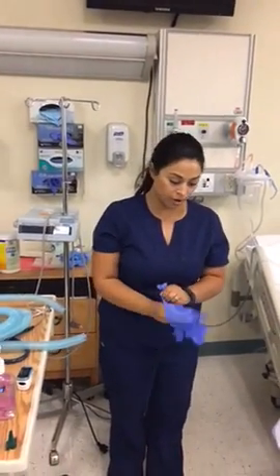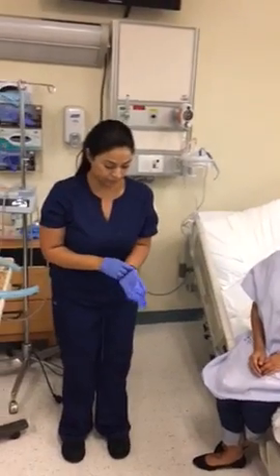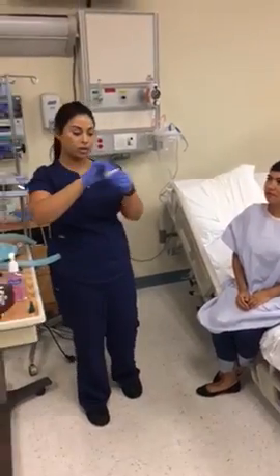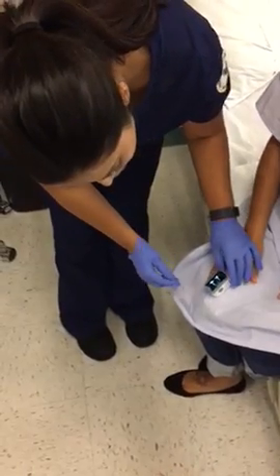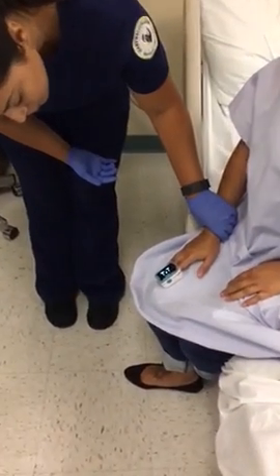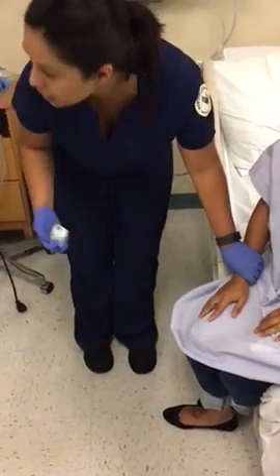So, how are you feeling today? I'm hoping to feel better after this treatment. Yeah, it really should, and we want to do our best to get you feeling better and get you going home. So first I'm going to get your saturation. I'm just going to be checking how much oxygen is in your blood. Okay, and your pulse is correlating with the pulse ox, so that's very good.